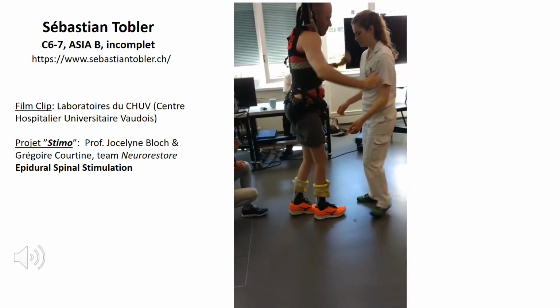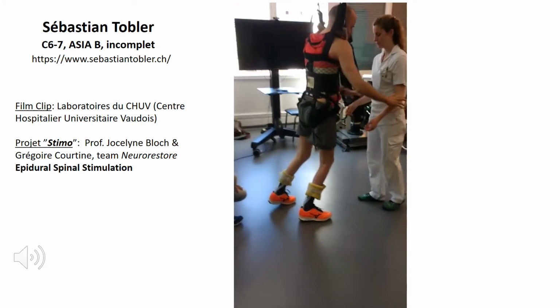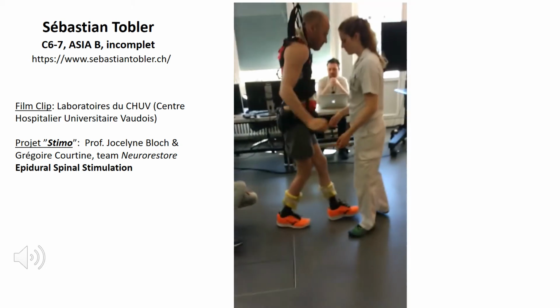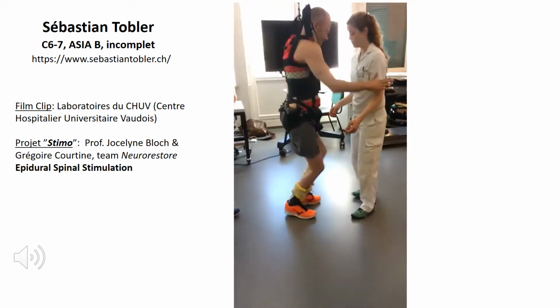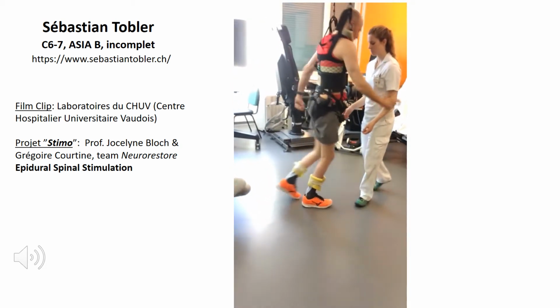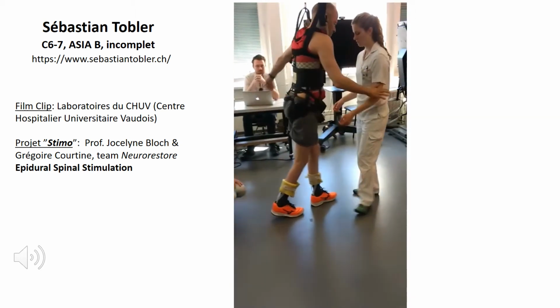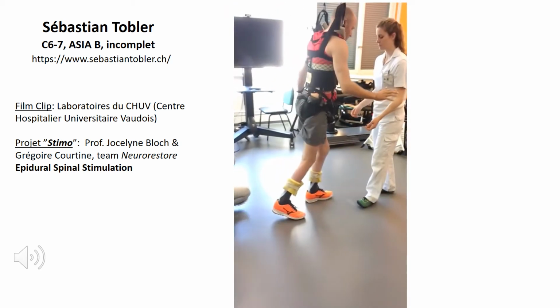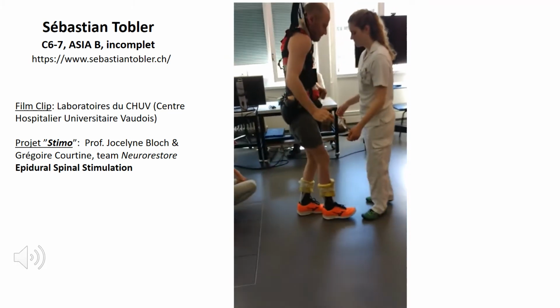This slide is an interesting one, and one of my heroes, Sebastian Tobler. Sebastian brings us through the connection of what we're talking about in my presentation and what we saw earlier with the epidural stimulation. He is probably the state of the art. As you notice, when he's walking here, he's not using a crutch or anything to support himself. It's really amazing. Now, Sebastian did not get here just through his stimulation. He works very, very hard with his physical rehab and other things that he does to promote his health.